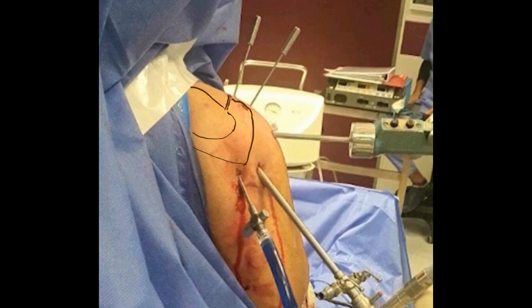Two measuring needles are used to mark the medial anterior corner and the lateral anterior corner of the acromion, and at the same time are used to measure the space between the anterior acromion and the rotator cuff in order to monitor the subacromial decompression. The third portal, the lateral anterior portal, is done immediately above the head for instrumentation. In order to avoid shifting of the portal, it is made after filling the subacromial space with saline.